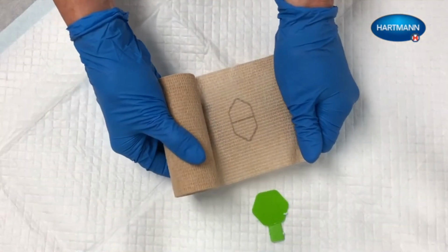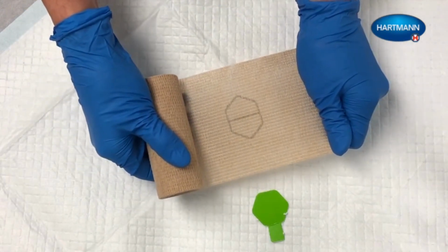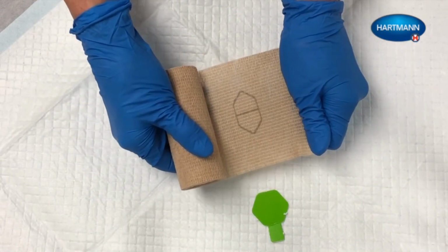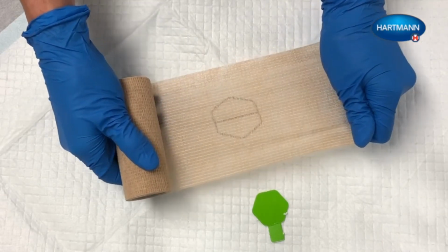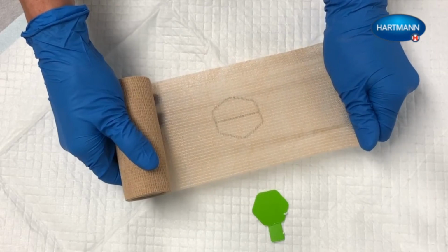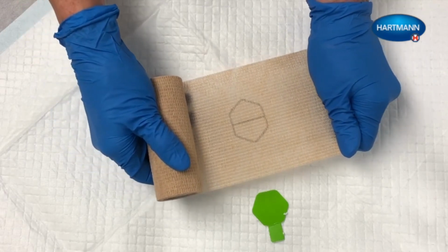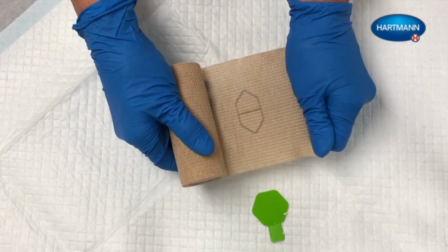In each TwoPress 2 kit, there is a green hexagon template to guide proper elongation or stretch of layer 2. Simply remove the template from the box and compare it to the indicator on the bandage. When overstretched, the shape is too wide. When the indicator is stretched correctly, you will see the indicator at the edge of the template. When the bandage is only slightly stretched, the shape is very narrow.